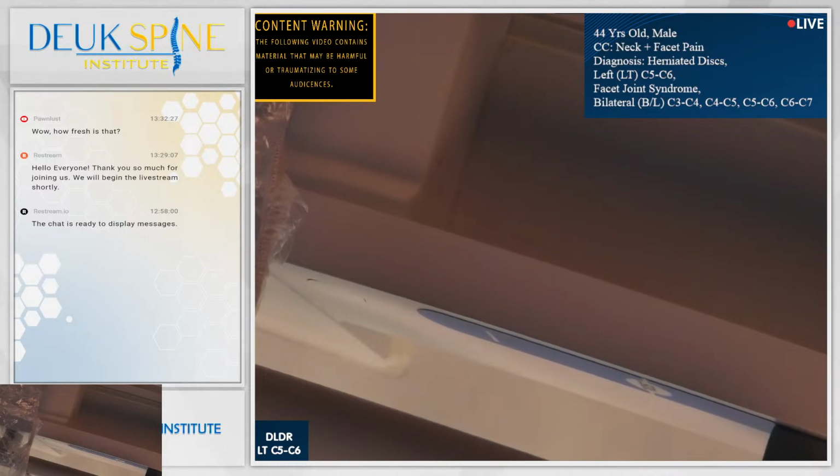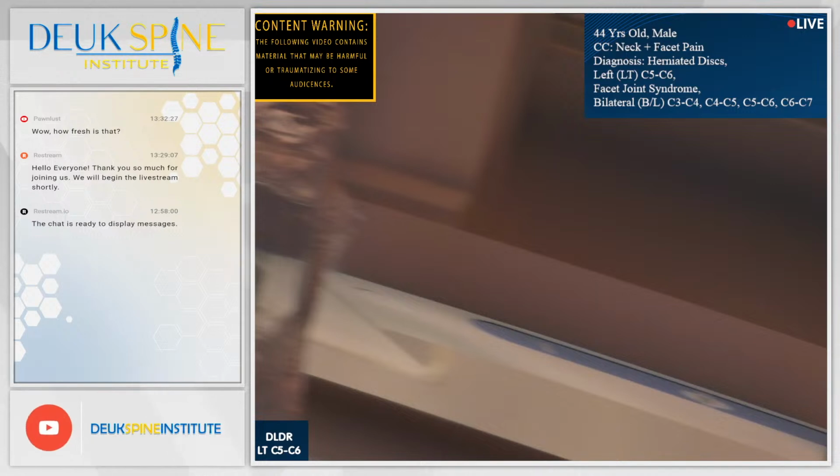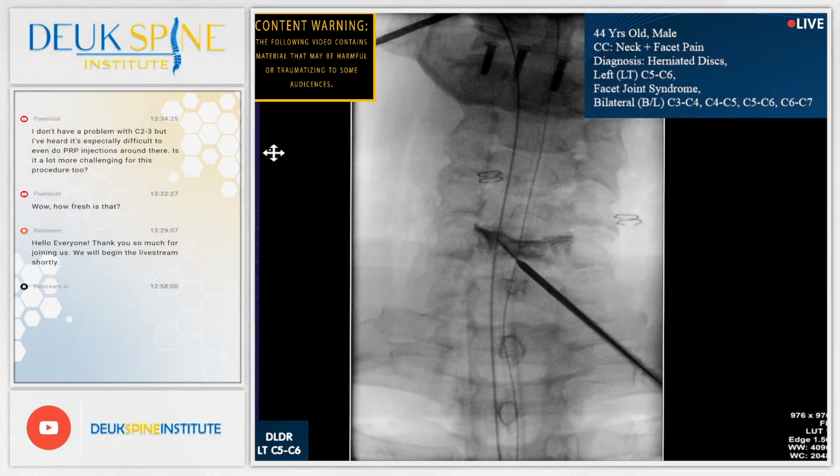Welcome back. You can see from our video, you can go lateral with the fluoro, but keep your picture. You can see from our animation that there are 30 things that cause neck pain, including 14 facet joints and 6 discs. Now just take a look at this front-back view. First of all, notice the tip of the dilator is in the middle of the spine, right where we want it, at the front of the disc, right?